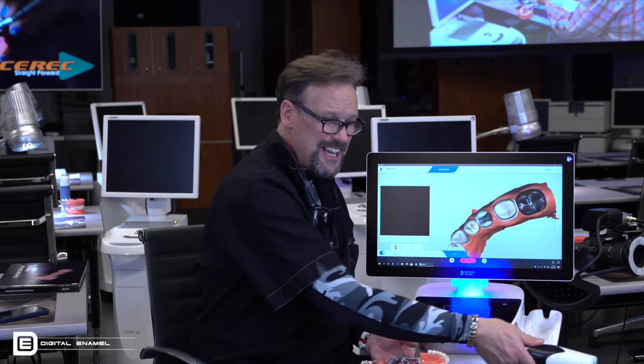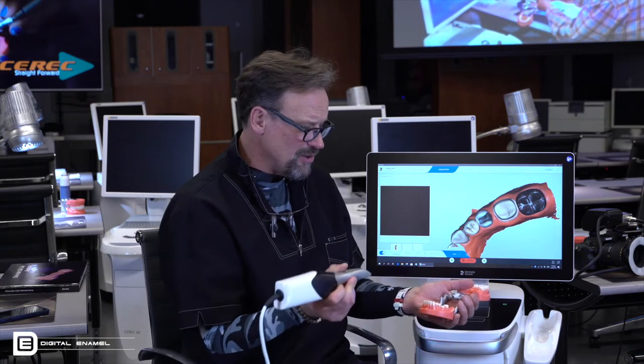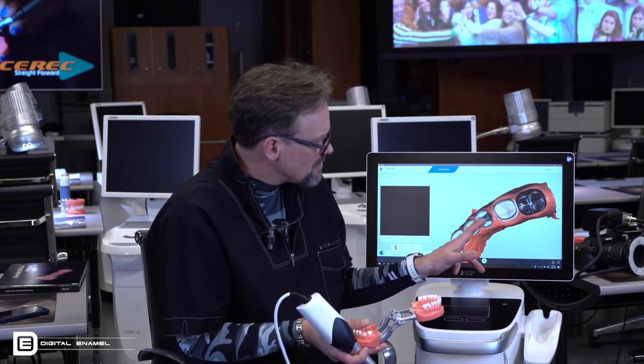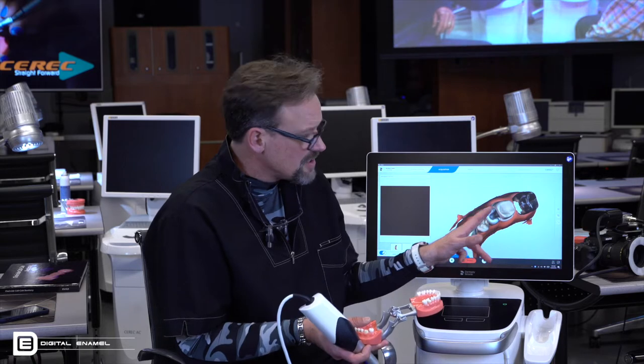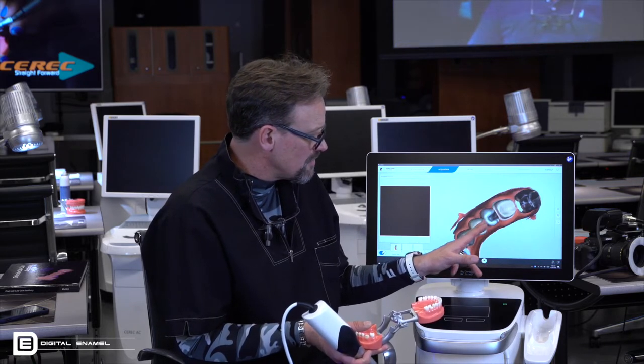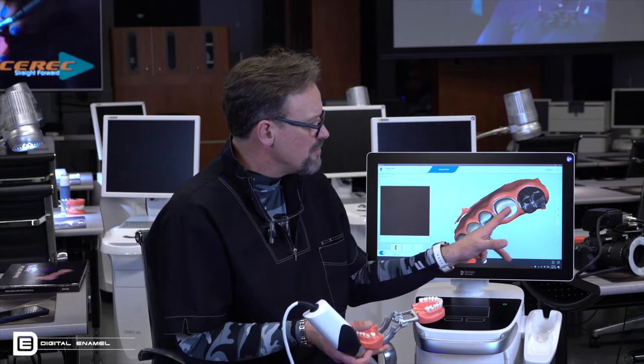Now, it's human nature to go, well, I'm going to put the camera right where it's missing, but this is just a computer. It has no intuition or anything. It only knows the data that you've put into it. So if you put it somewhere that it already knows, like the premolars, what I call the pivot point, and then move to it, it's going to go even faster.